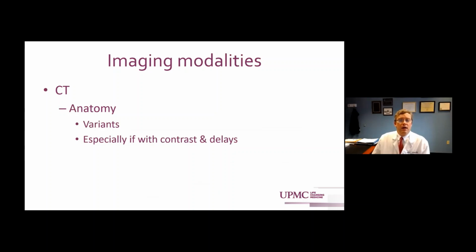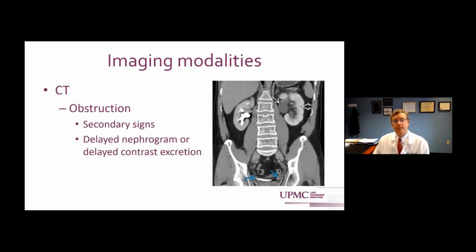Okay. CT scan, again, as I said, good for almost everything in stones, and including the different types of anatomic variations. There's also variations in the CT scan of how you can do them. We're typically talking about non-contrast CT scans, but you can get a lot more information on the anatomy if you use contrasted CT scans, delayed images, the so-called CT urogram, and those are certainly important if you see something on the non-con scan that you need to evaluate further before proceeding with stone treatment.